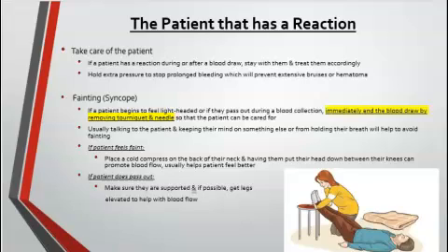If you have a patient that begins to faint or does faint during a blood draw, you need to immediately stop the blood draw by removing the tourniquet and the needle and start to care for the patient. If you can tell that the patient might be going to faint, you can try to get their mind on another subject by talking to them, or you can make sure that they're breathing. Sometimes patients will want to hold their breath, and you can make them concentrate on their breathing by telling them to breathe.